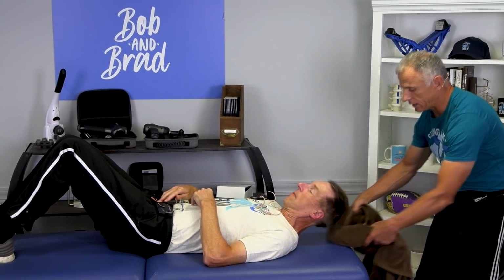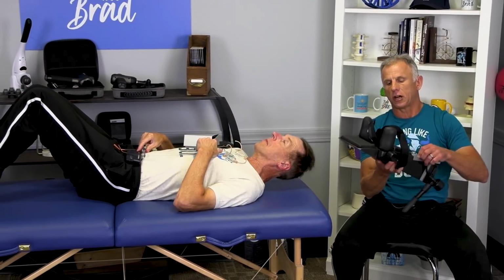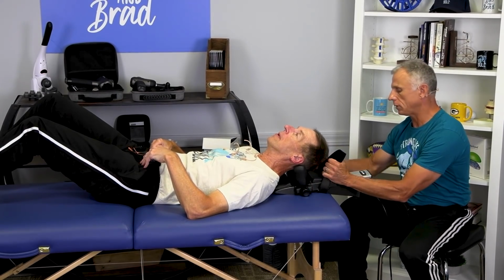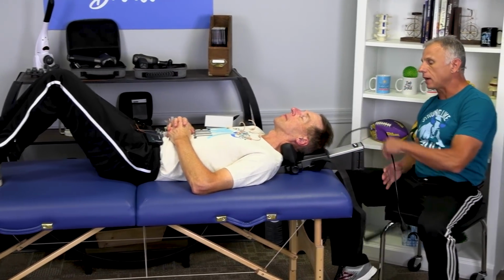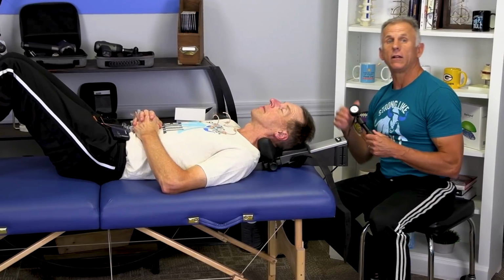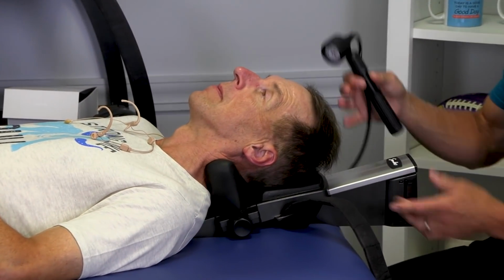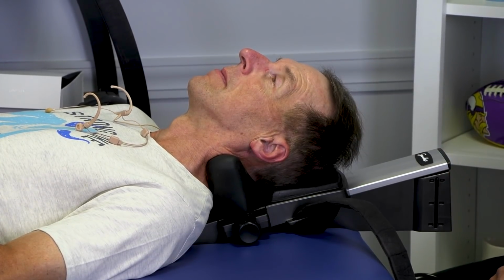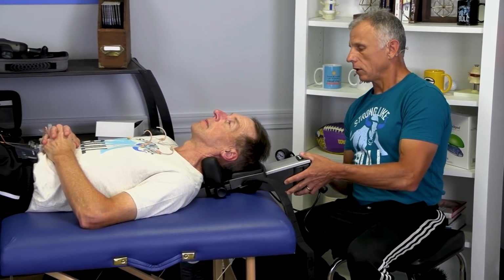Now, if that works out good and you're sick and tired of doing this and you're getting good results, you can purchase a Saunders. Now, there are different manufacturers. I'm going to promote Saunders. We get absolutely nothing from it. I just know from personal and professional experience that these are nice units. I'm not going to go through how to work these in detail. There's a Bob and Brad YouTube on the cervical Saunders traction unit, and it's about a 15-minute video that goes into detail on how to use this. They're excellent. You can do it all by yourself. You don't need anybody else to help you, and you'll get good results with excellent control with this little hand pneumatic pump. So we're not going to go any further into that, Bob.